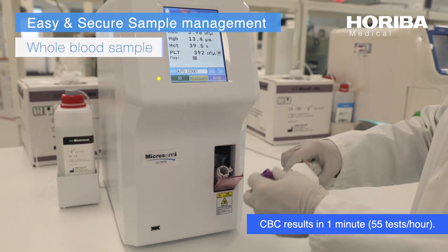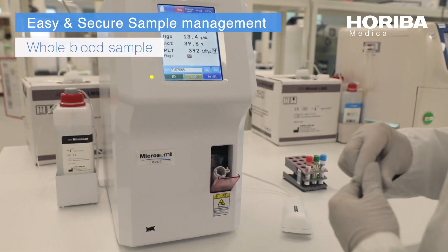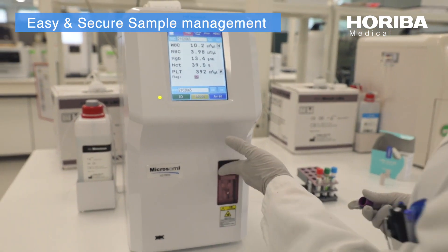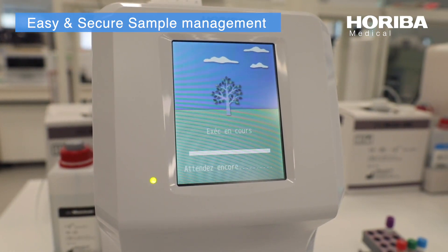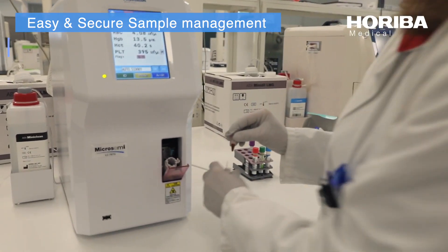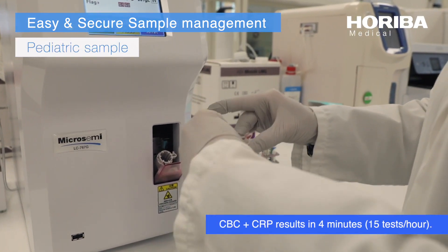CBC results in 1 minute, 55 tests per hour. CBC plus CRP results in 4 minutes, 15 tests per hour.